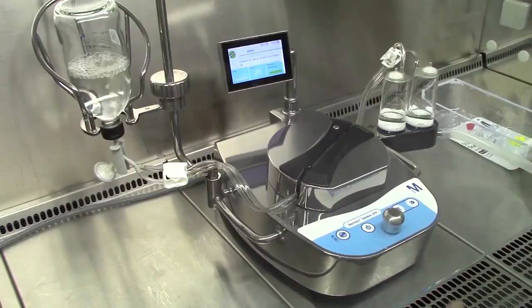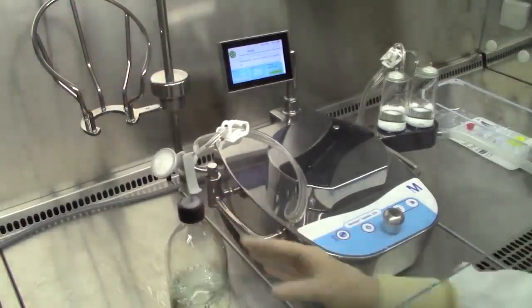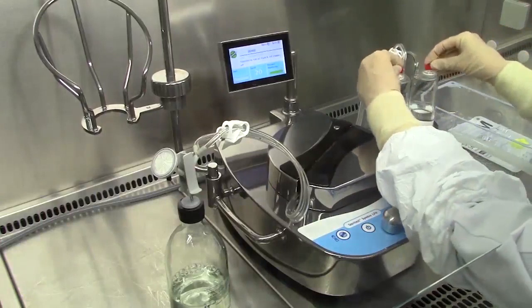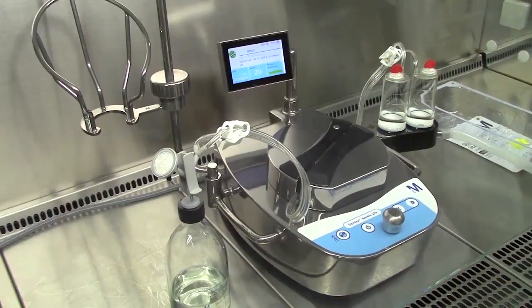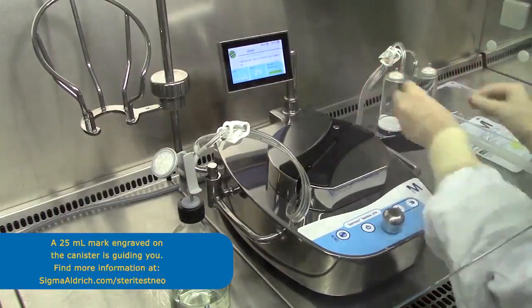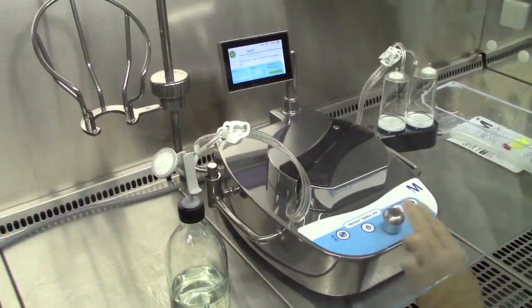Remove the pre-wetting fluid container from the bottle holder and place it upright on the work surface. Aseptically place a red plug onto each of the canister's air vents. Allow some of the pre-wetting fluid to filter through the membrane. Remove the red plugs when there is approximately 25 milliliters of liquid left in each canister. This will ensure that the test product will be suspended. Stop the pump.